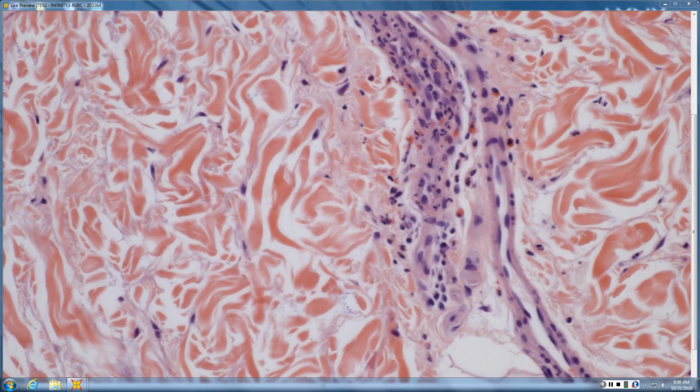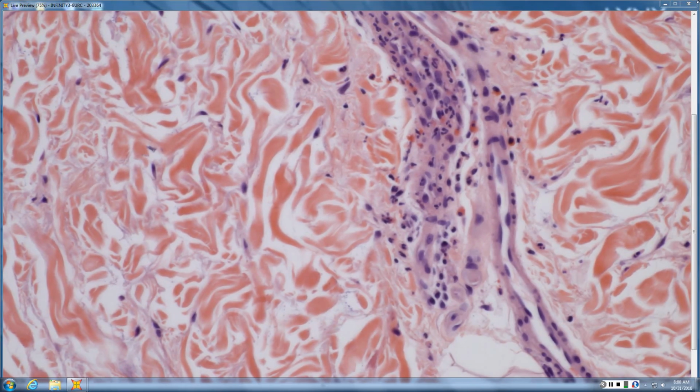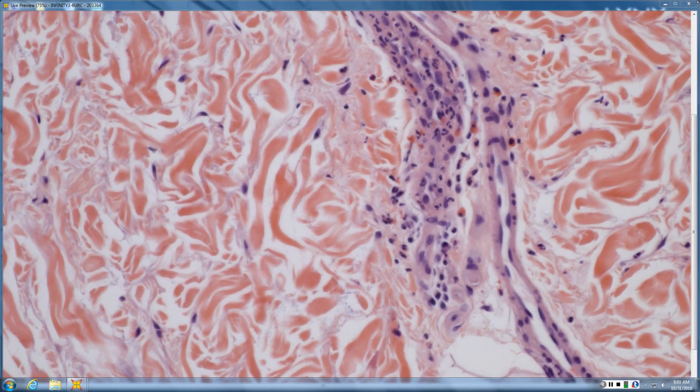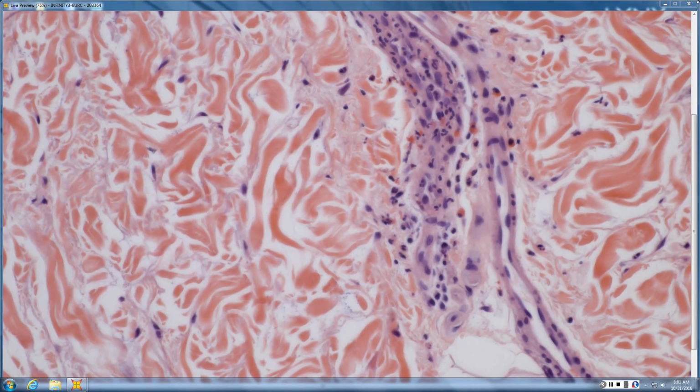I sometimes get those weird little IP-looking dyskeratotic cells. That was the next question. You brilliantly pointed it out. What we just described was the acute urticarial rash of Still's. But Still's patients also get a more persistent, often papular rash. The neutrophilic look without karyorrhexis is one look for Still's. Another characteristic look for Still's is a ferritin of 2,000. If you have a patient with a ferritin of 2,000, you're probably dealing with Still's.